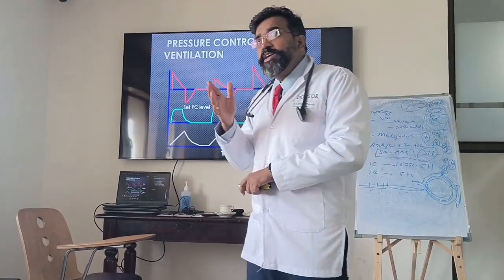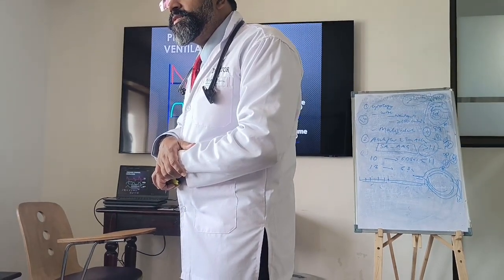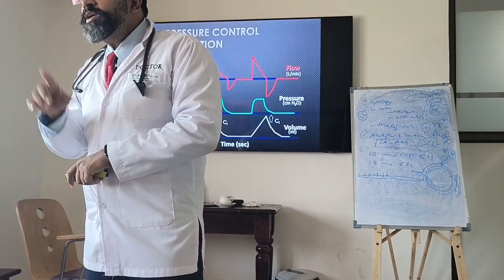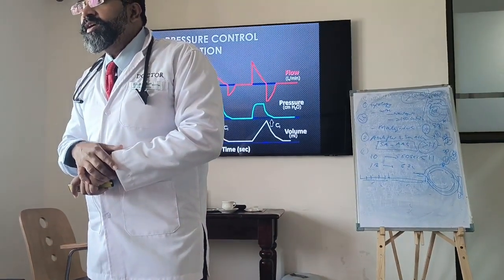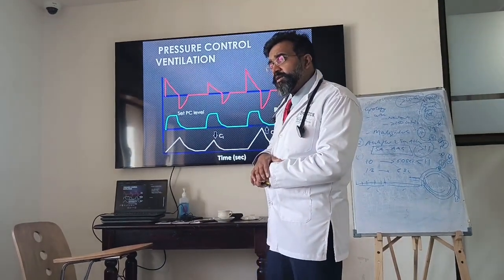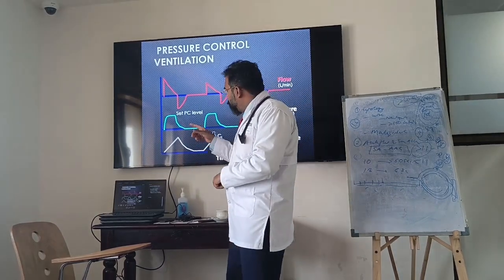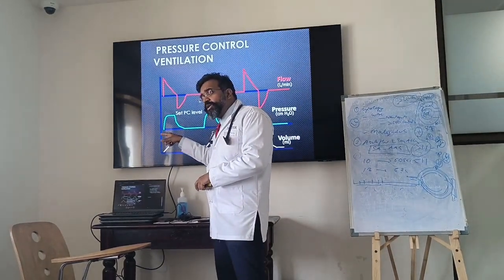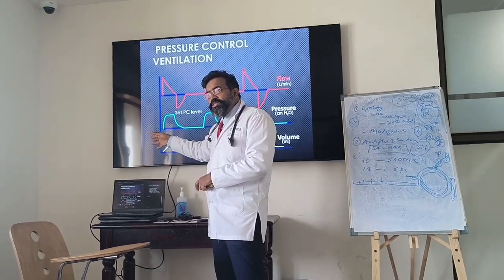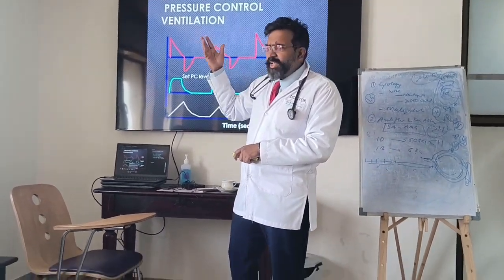Machine trigger. Why is it machine trigger, Kanchan? Because it's cycling. It's positive. What is trigger? Time. What initiates them? How is the breath getting initiated here? Positive. Is the patient doing anything here? How do you know it's not doing anything? It's all positive. So what do you think this is? Time trigger. That is machine or time trigger.